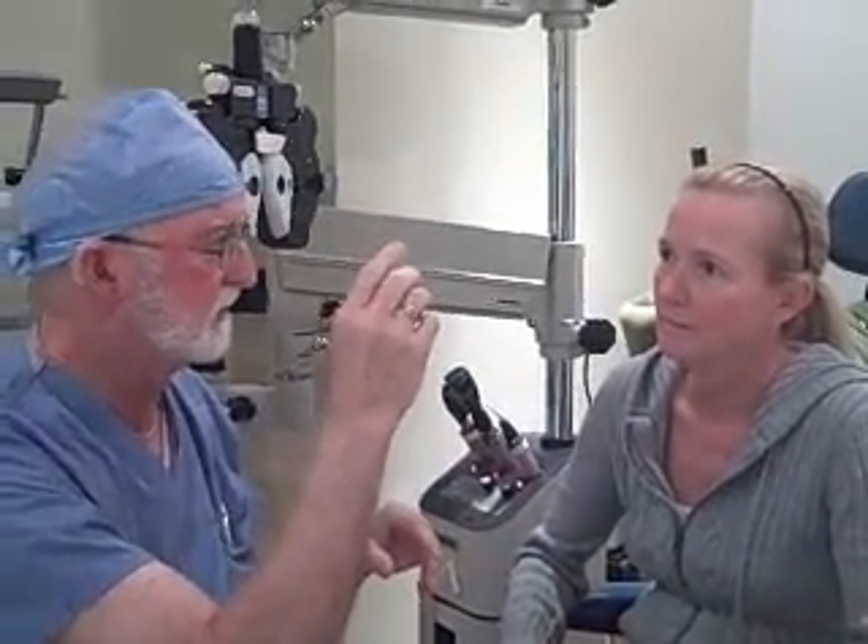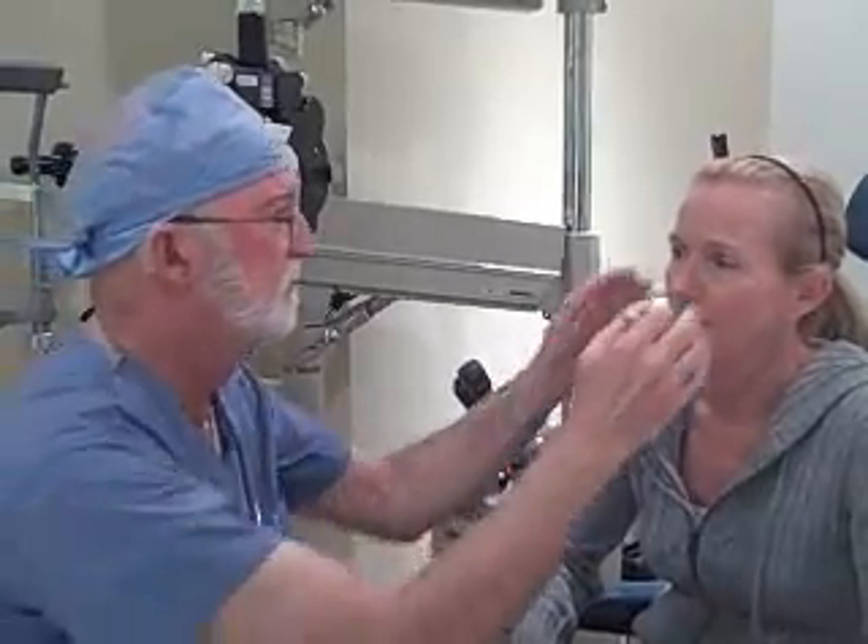So the first step is making the LASIK flap. You'll be on a chair like this, and we're going to flip the chair back. We're doing your right eye today — that's going to be the reading eye. You'll be lying flat and you'll see a little circle of light. We put a suction ring on your eye. When I do that, you'll feel light pressure on your eye and your vision will blur out. Then we dock the suction ring into your eye, and you're going to feel more pressure.